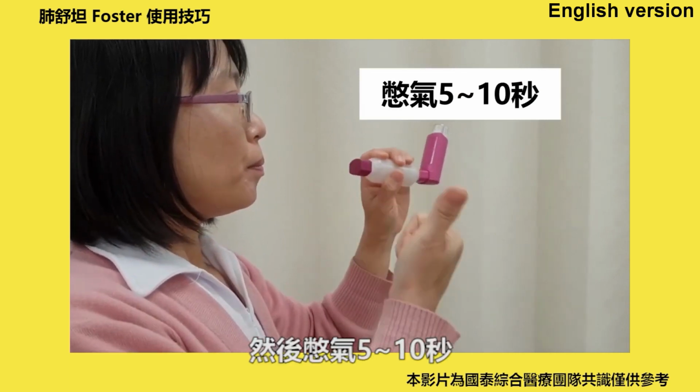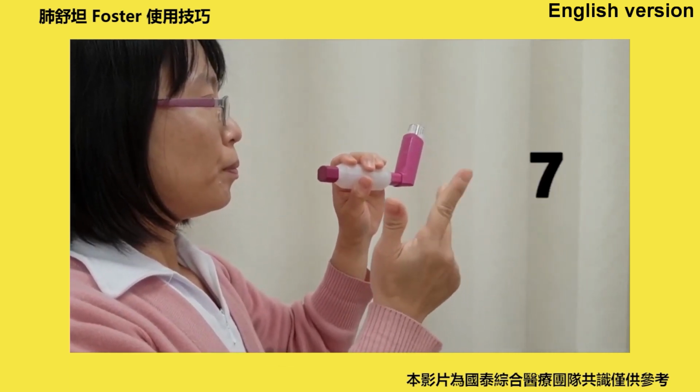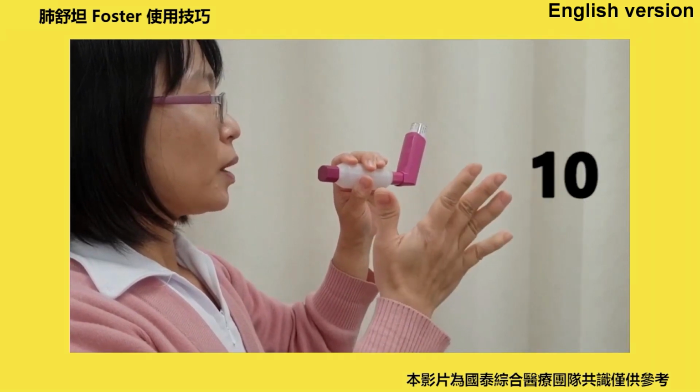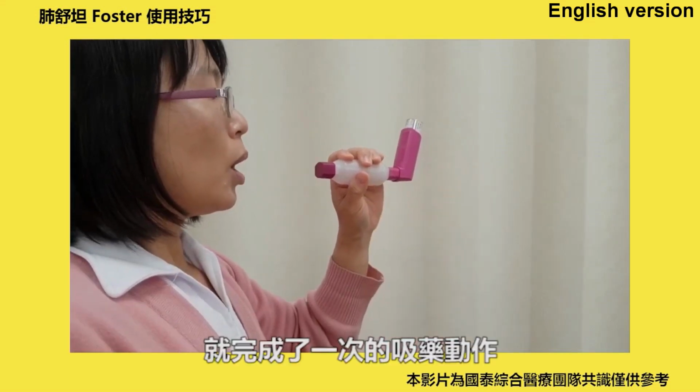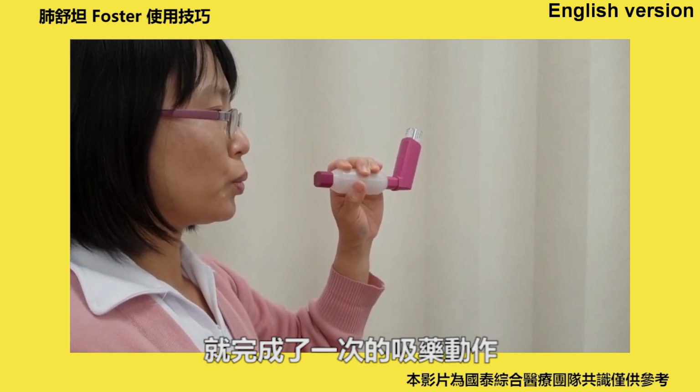Take the inhaler out of your mouth and, with your lips closed, hold your breath for 5 to 10 seconds. Then breathe out away from your inhaler. When you have finished, replace the cap on the inhaler.